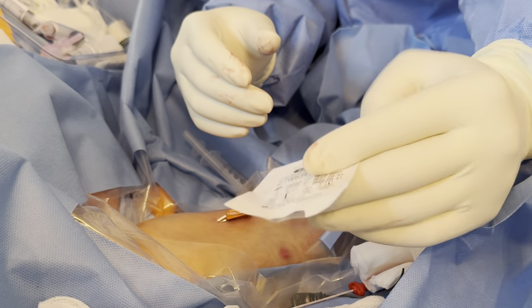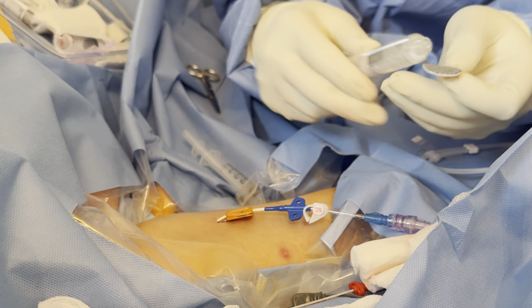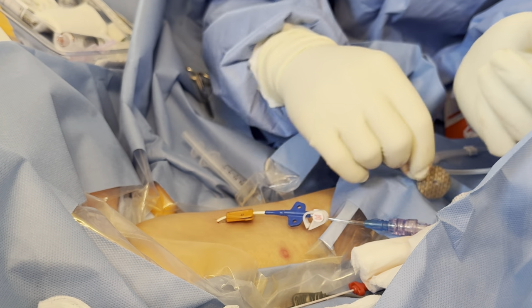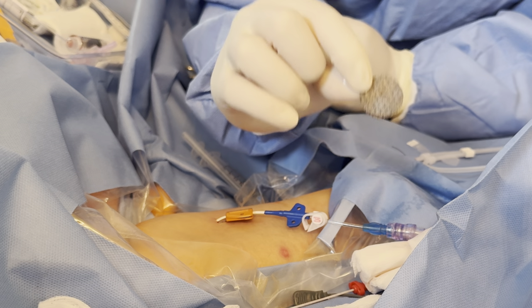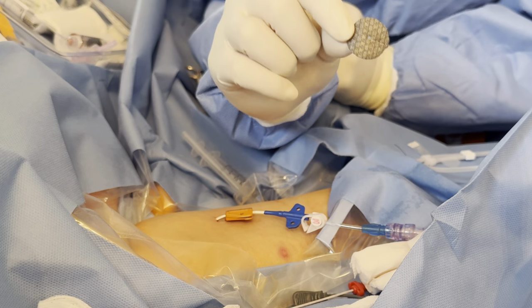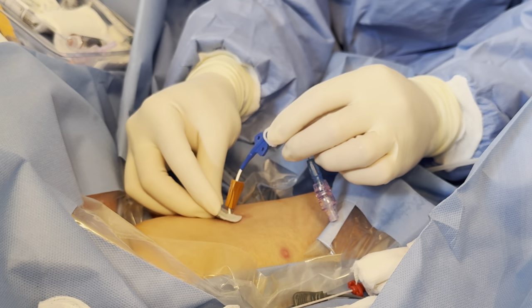Now I'm going to show you guys about the silver disc — this is where a lot of people get confused. This is Silveron — a silver-activated antimicrobial. With silver discs, you have to give it a few drops of saline to wet it; if it's not wet, you'll decrease the efficacy. This dark piece is the antimicrobial activity — not the white part. This is the opposite of Biopatch, Gardeva, and most of your CHG discs. This dark part is the silver itself, and you want this in contact with the skin. Don't get that confused. So we're going to apply that.